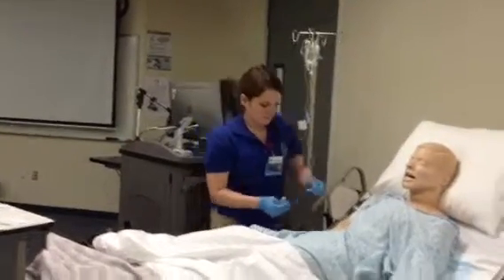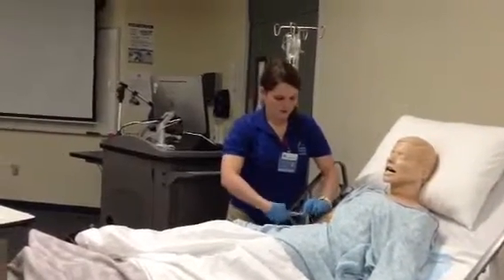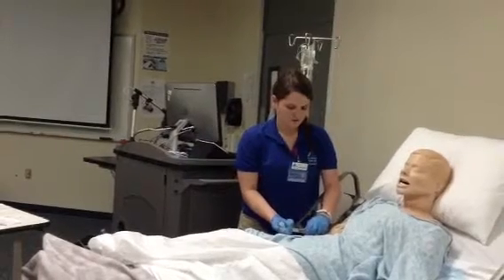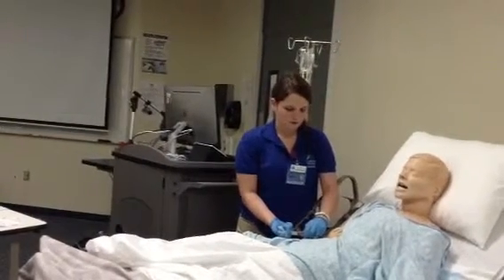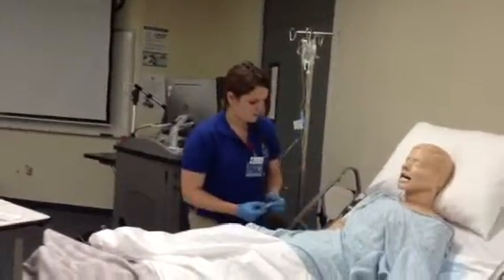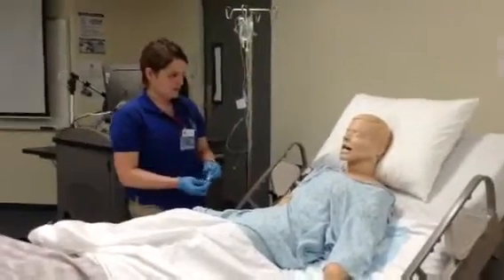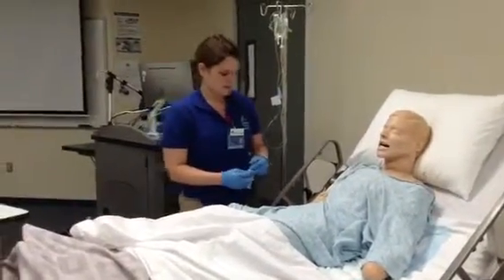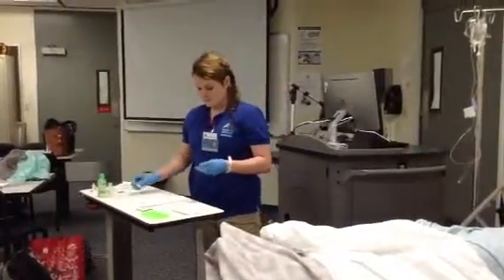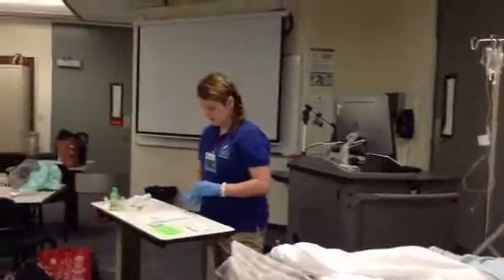So I'm going to clean off his port. And I'm going to finish flushing with the other 3 milliliters with the push pause, push pause, push pause. Ready? I'm going to check the site again, make sure there's no phlebitis or infiltration. Looks good. How are you feeling? Good? Alright. And all of this would go in the sharps.